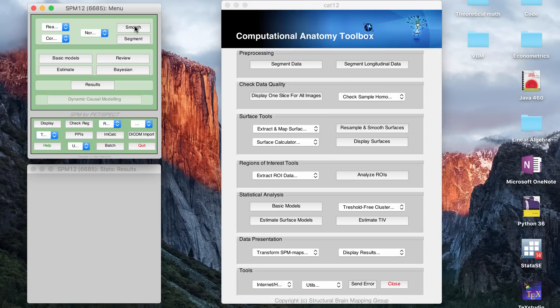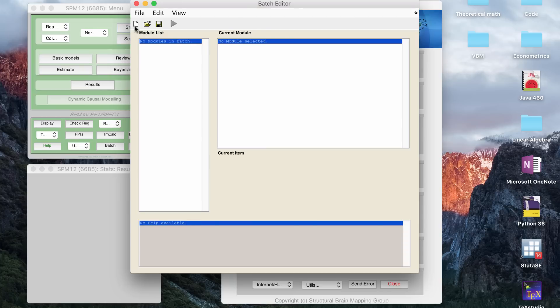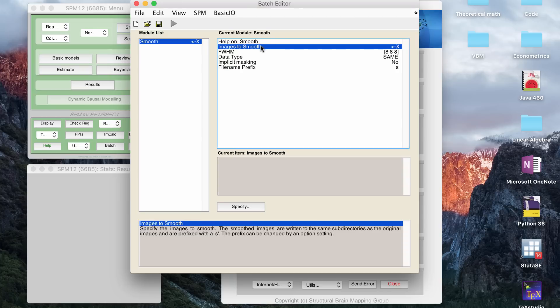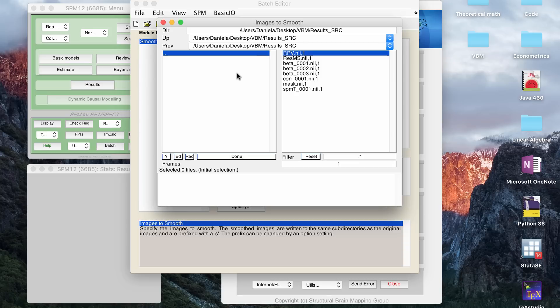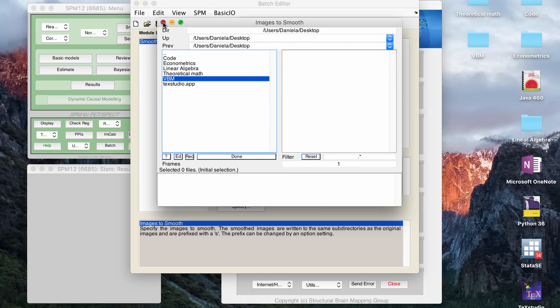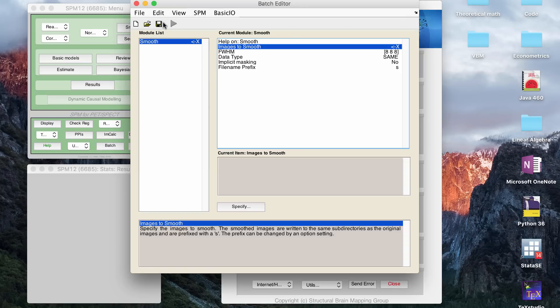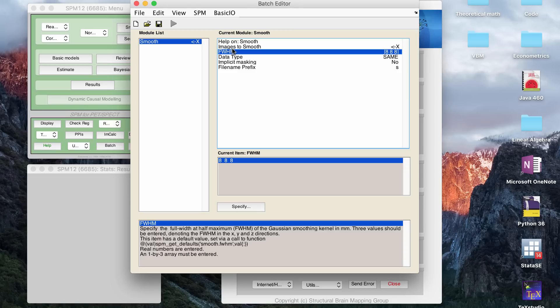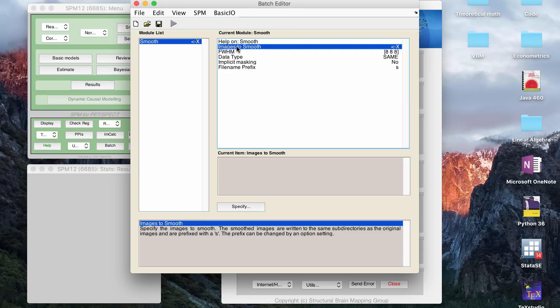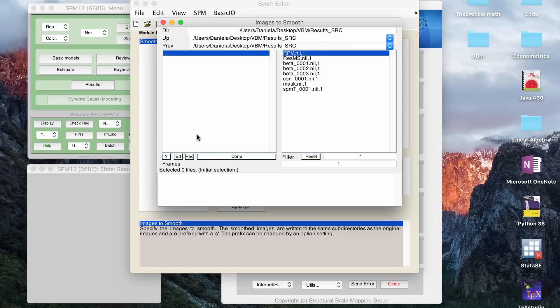So it segments gray and white matter, and then the next step that you want to do is you want to smooth the data. So to smooth the data, you go to the SPM12 GUI, and you click the smoothing button. Then what you're going to do is you're smoothing the gray matter files. So you're going to smooth the MWP1 files, and again you want to do this, the same smoothing kernel for all your subjects. So you put in all the NIFTI MWP1s into this file. So you click it, and then you click done.